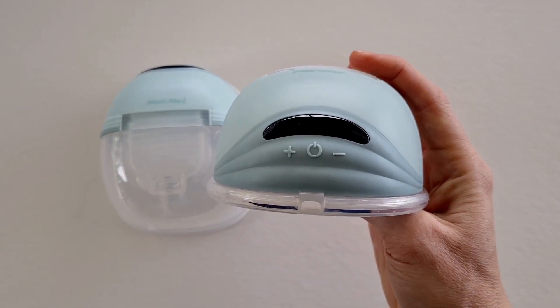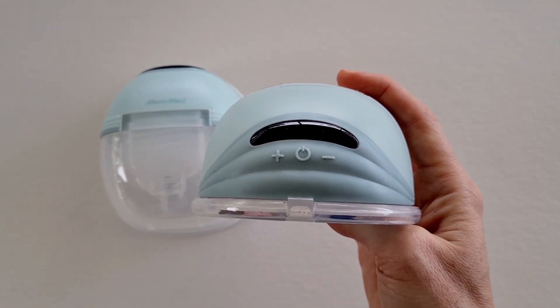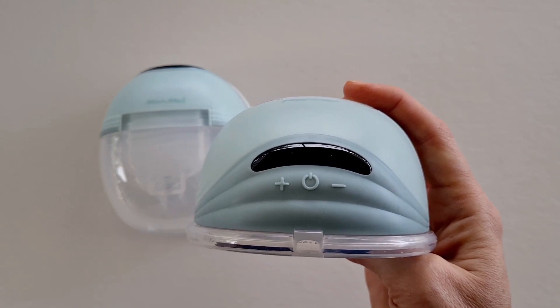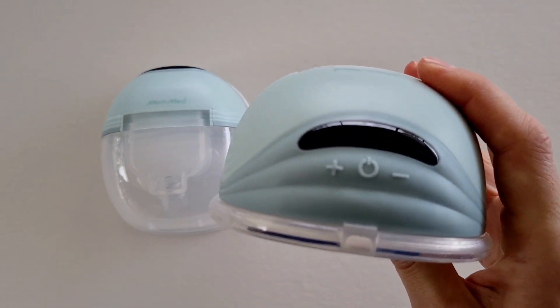I also really love this curved screen. If you can imagine this is in your bra and you are looking down, the screen is actually really easy and visible to see, and the curve just makes it that little bit easier for that quick glance, which I love.